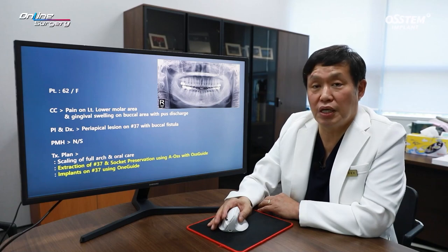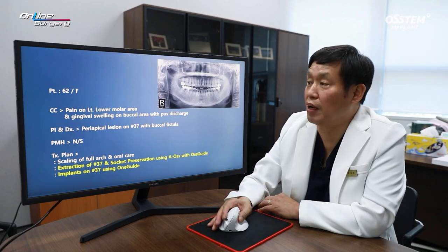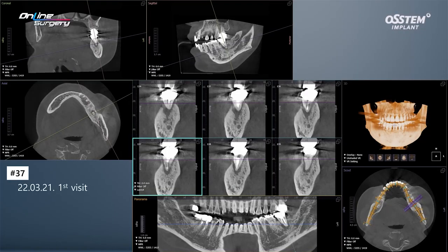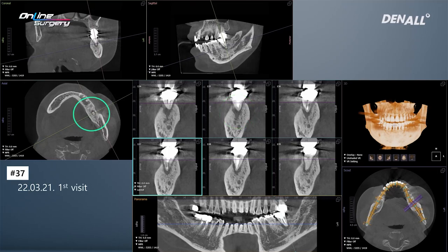One guide was used, and an implant was placed in number 37 using one guide. This is the CT image at initial visit of number 37. Because of the periapical lesion, you can see bone destruction. However, compared to the level of destruction, the buccal wall is still there.